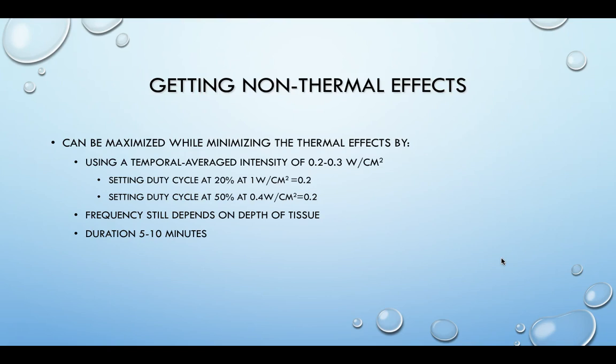So with trying to get non-thermal effects, our whole goal here is that we're just trying to limit the thermal effects. So we want the body to be able to dissipate any heat that is being created from the ultrasound so that the tissue temperature doesn't actually rise, because in most cases that would be contraindicated when we would be using non-thermal. So we'd usually be in that acute inflammatory stage when we're talking about only using non-thermal.